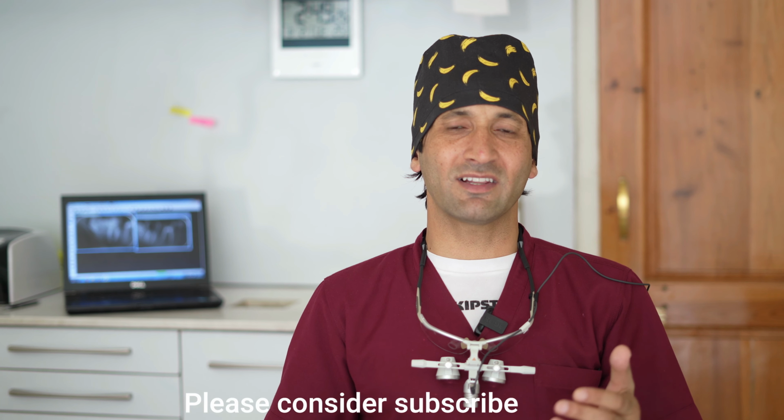So I discussed everything with the patient: the problem is here, and the problem is not that root canal treated tooth. Although he had the root canal treatment done by another dentist a couple of months before, it's not as good as it should be. Only half of the roots are filled with the obturating material, so I told the patient to go for treatment of this tooth. We will do this after that case.